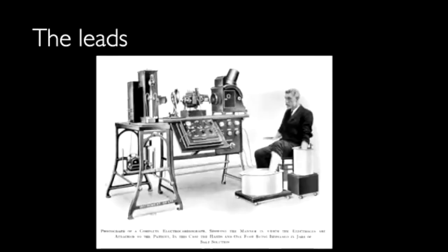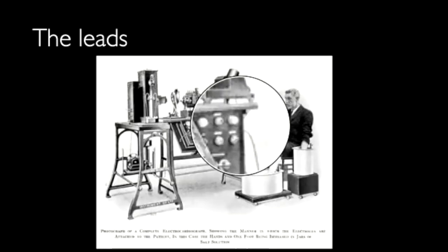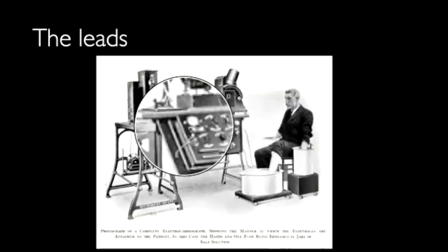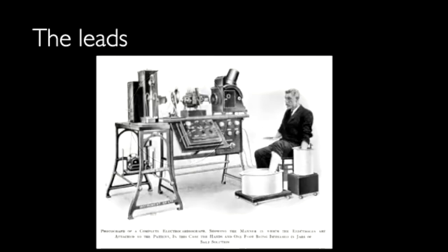How did it start out initially? This is kind of cool. You've heard of Einthoven. I think this is actually Einthoven. This is the early EKG. You see what he's got. He's got a bunch of circuitry back there, and that's not really the important part. He's got a way to view it here, conductors, essentially sensors, here, and then a little bit of processing stuff back there. Again, this can be the size of your iPhone now with really no difficulty, but this was a room-size thing.